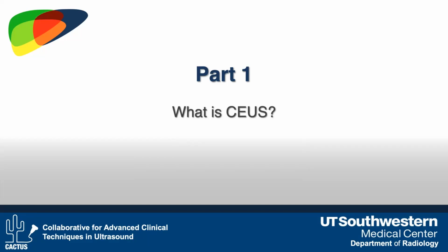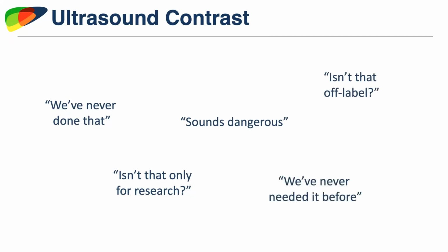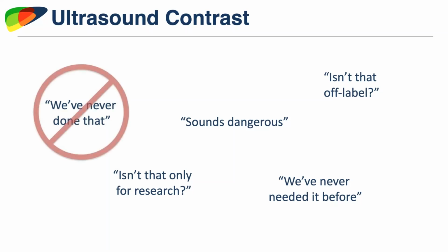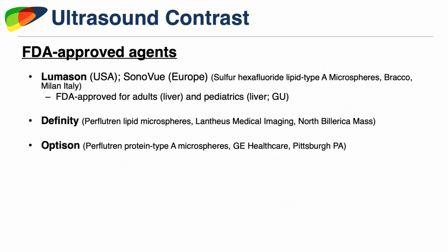So part one of our talk is what is contrast enhanced ultrasound? Here in the United States, it's had a hard time getting a foothold because of some probably unfounded preconceived notions about its safety and about the need for FDA approval of its contrast agents. So keep in mind that none of these reasons should be reasons to keep you from starting. It is incredibly safe. It's no longer research. It is now on label. So for those of you who may have been hesitant in the past, I encourage you to tackle it now.